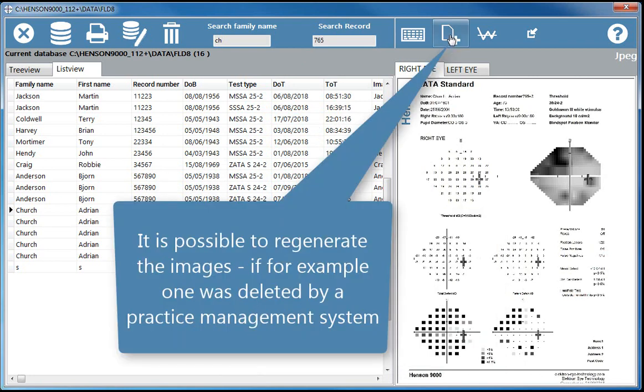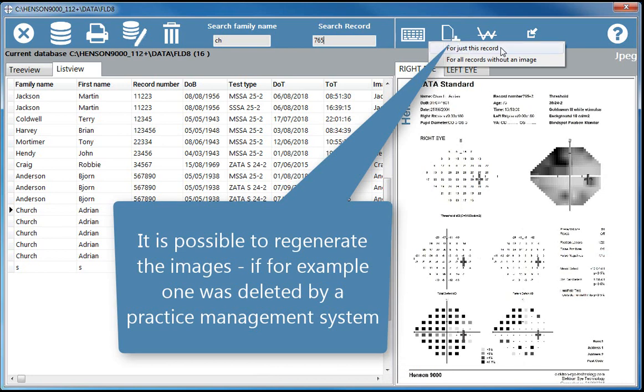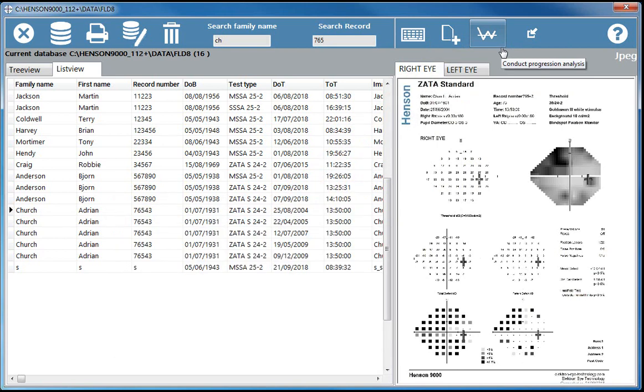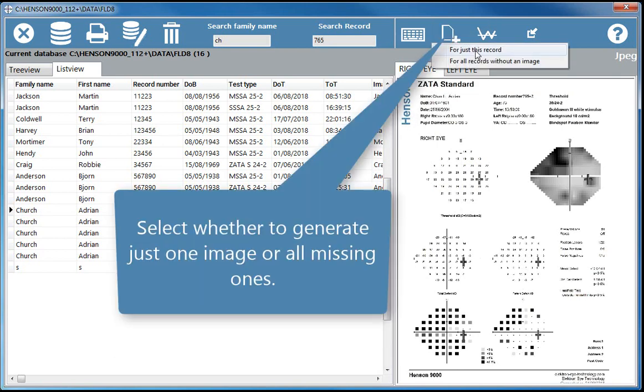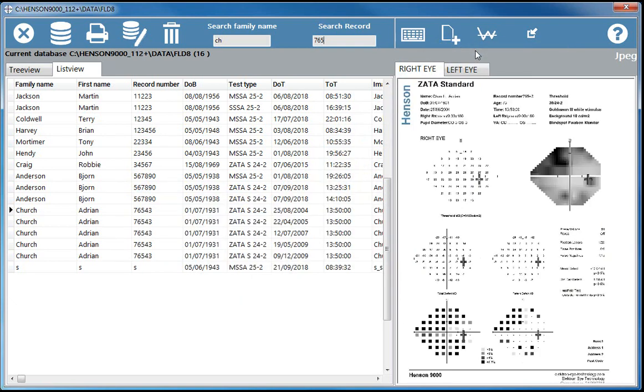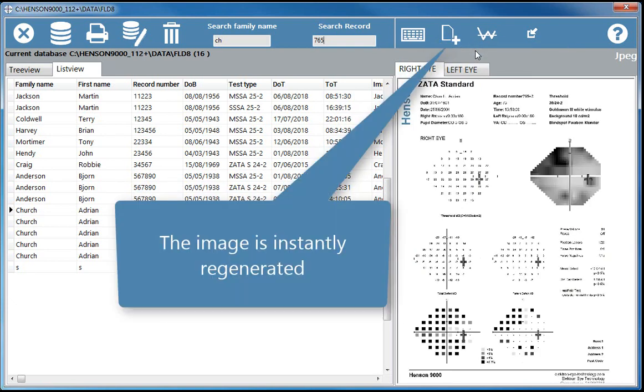It is possible to regenerate the images if, for example, one was deleted by a practice management system. Select whether to generate just one image or all missing ones. The image is instantly regenerated.